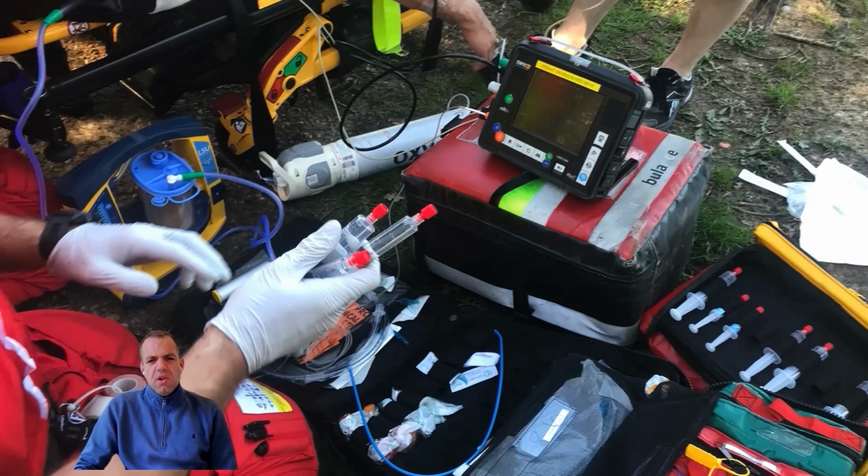All of these things, unless we timestamp them directly onto the monitor, we tend to not really accurately record in terms of time and when they were given. Very often we get to the hospital and we sort of summarize it and we kind of guess a little bit as to when those times happen.